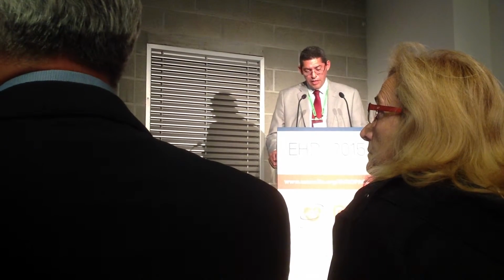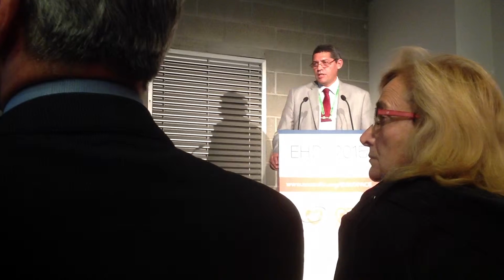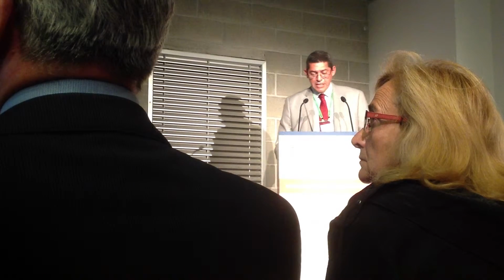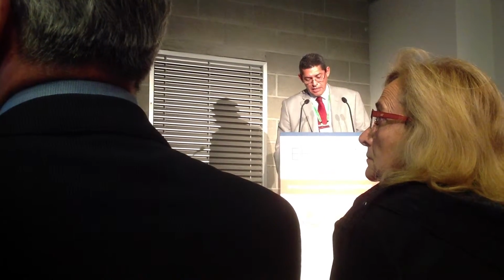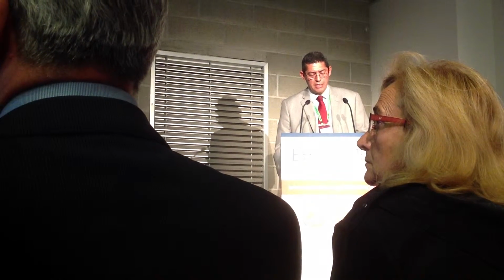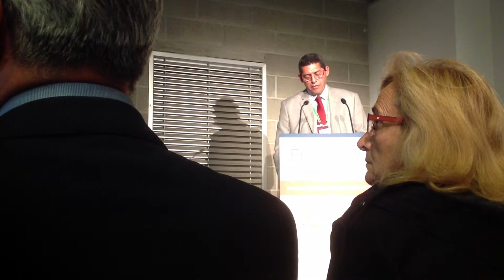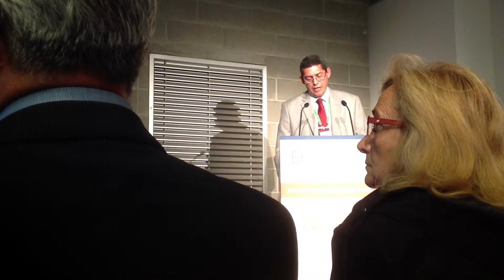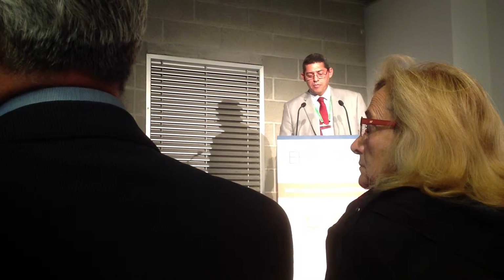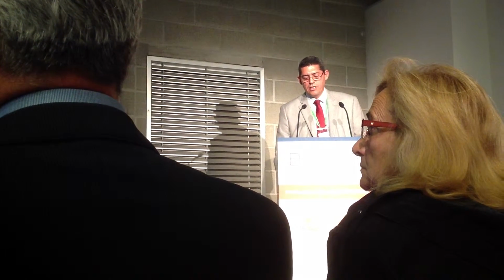And finally, let me comment on a very interesting field of investigation, a challenge study. We performed this multi-center study that was presented in these scientific sessions. We included 62 patients with primary prevention indication for ICD implant and high burden of PVCs. We performed ablation in all of them, and we performed a follow-up of 6 to 12 months. In patients with sustained successful ablation in the follow-up, 63% of them no longer had the indication for primary prevention ICD implantation.